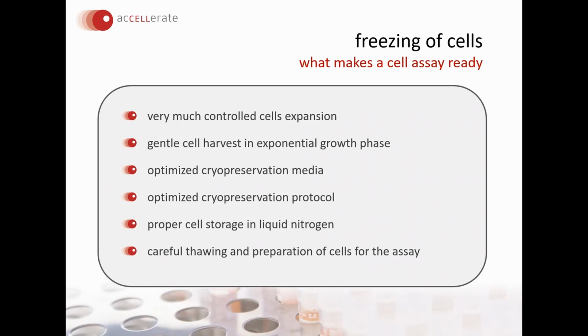So the question is, what is actually the difference between preparing a regular cryo stock of cryopreserved cells and Assay Ready cells? And the answer is, in fact, there is no real difference. The difference is that you have to keep in mind that you want to use the cells in Assay Ready format, that you have to cryopreserve them at a highly functional level. So there's no secret ingredient, there's no proprietary technology in preparing these Assay Ready cells. It's simply the know-how, how to handle it and to do it right.